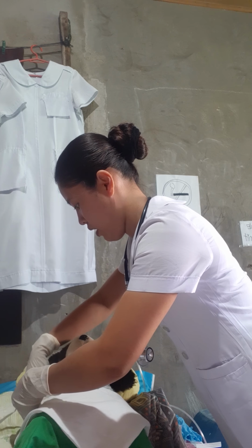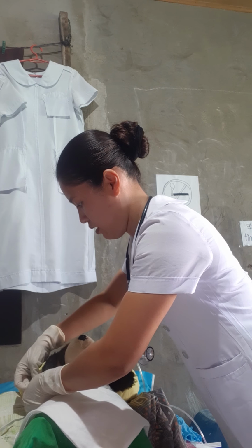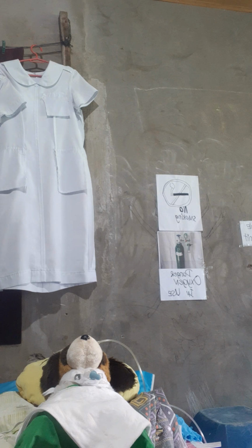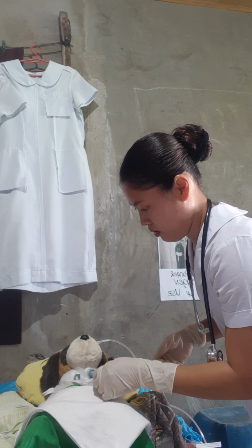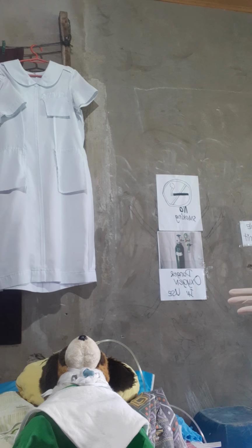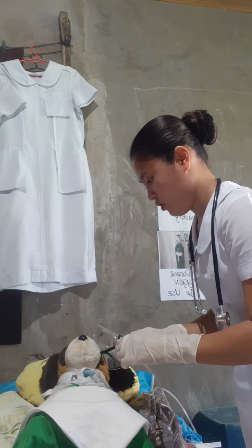Make sure that when we tie this one, we leave a space of one finger so that it's not too tight. And it should be nice, and we need to place back the oxygen device.